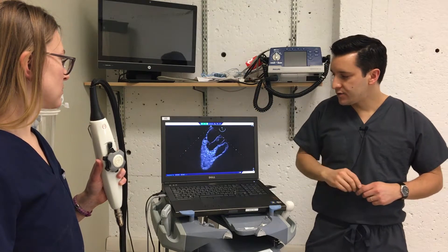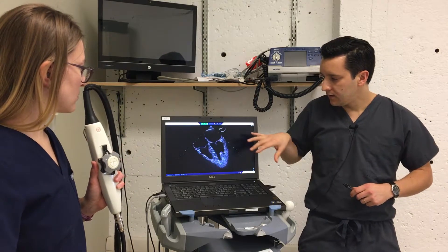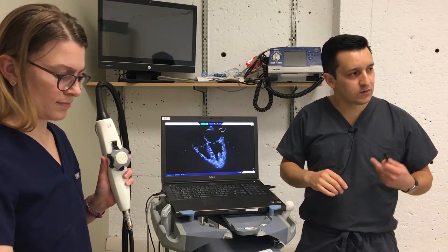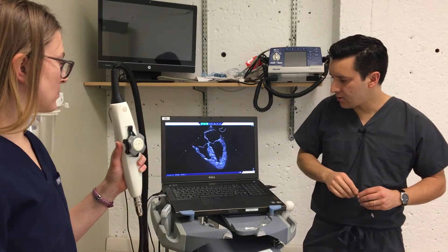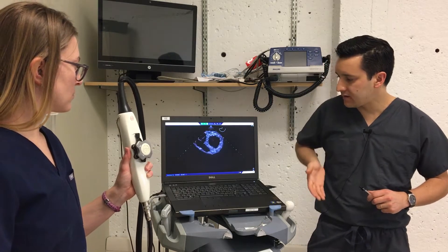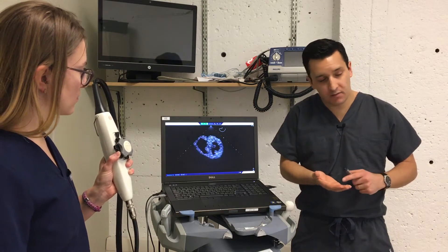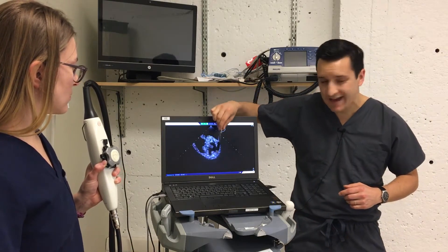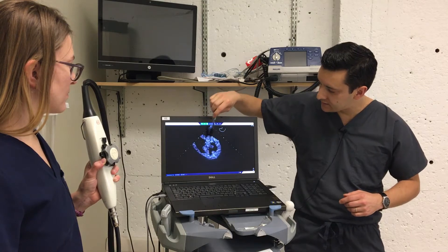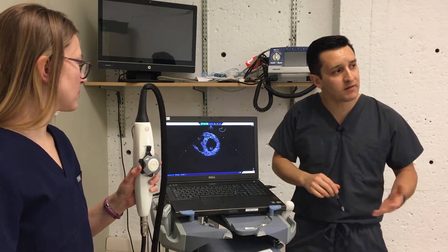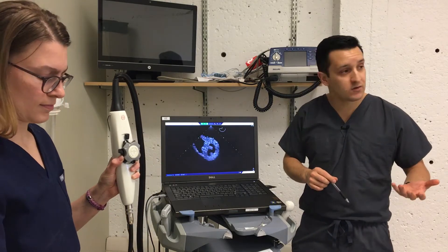Once we've completed this view, we're going to go back to omniplane zero — neutral or horizontal position — which brings us back to the four-chamber view. For the third view of the protocol, the transgastric short axis view, we make sure the big wheel is free with no significant anteflexion, and we advance the probe into the stomach out of the esophagus. We then apply a little bit of anteflexion with the big wheel to re-establish contact of the probe with the wall, developing the transgastric short axis view at the level of the papillary muscles. As you can see, we have a nice round LV, septum, and the right ventricle — similar to the transthoracic short axis view.